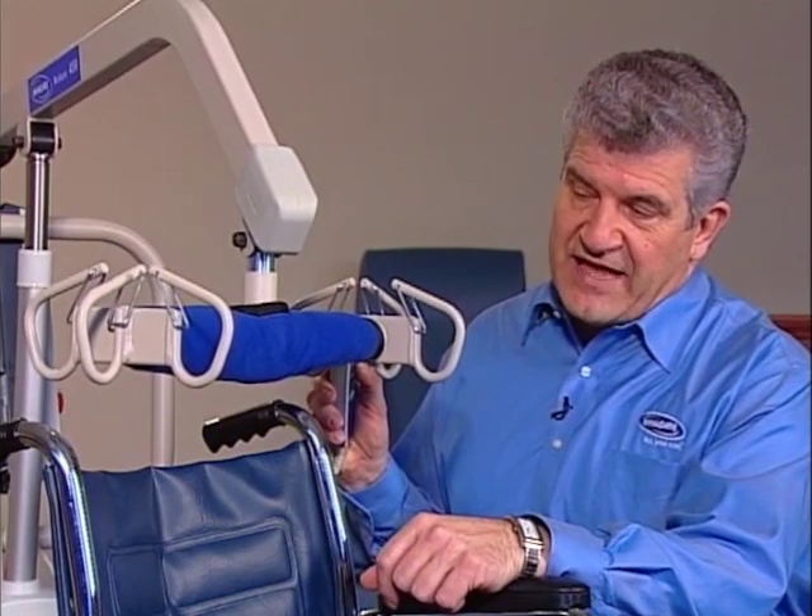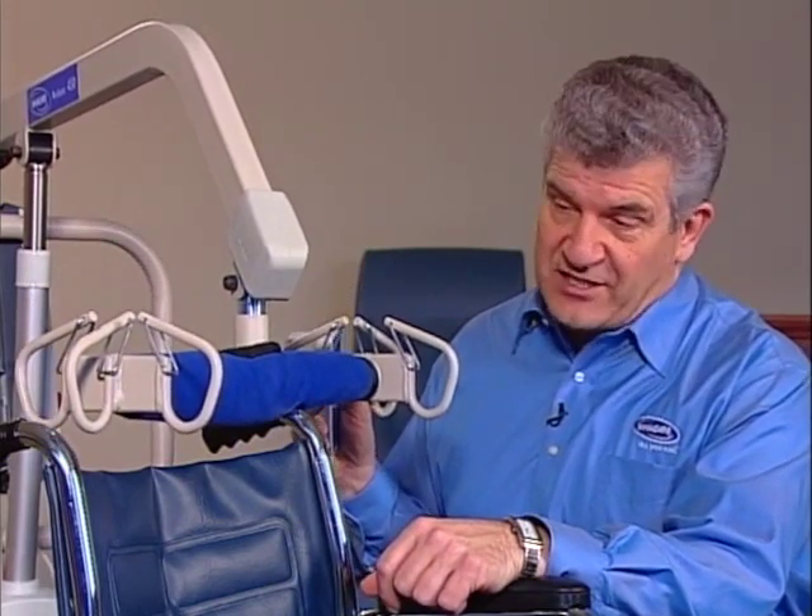Another safety feature built into all our battery-powered lifts is an anti-entrapment capability. An internal sensor will automatically stop the lift if it meets any kind of resistance while it's lowering.